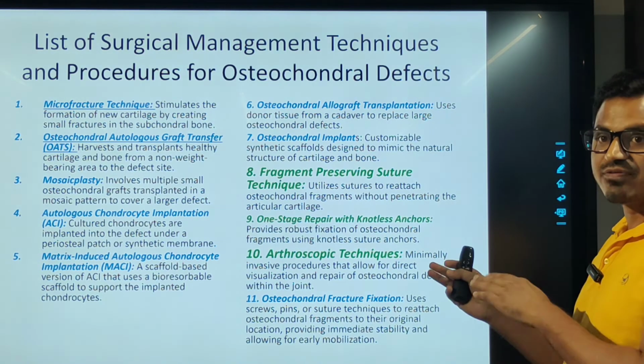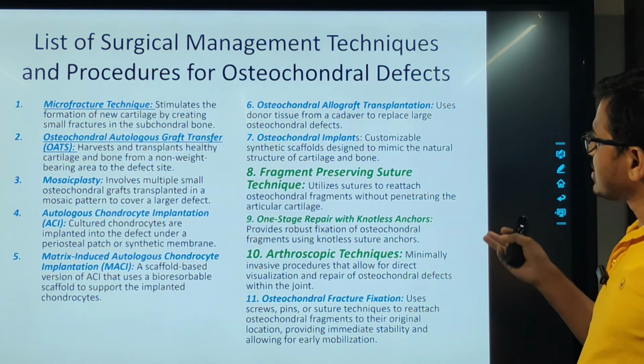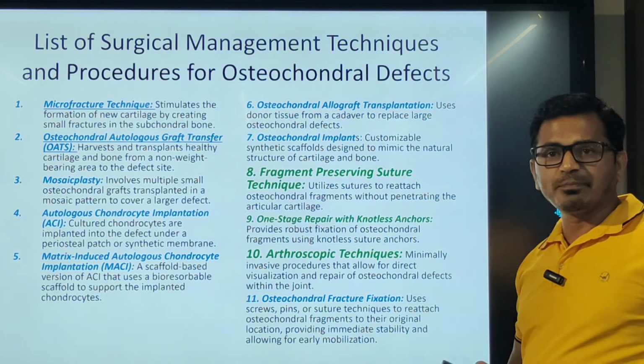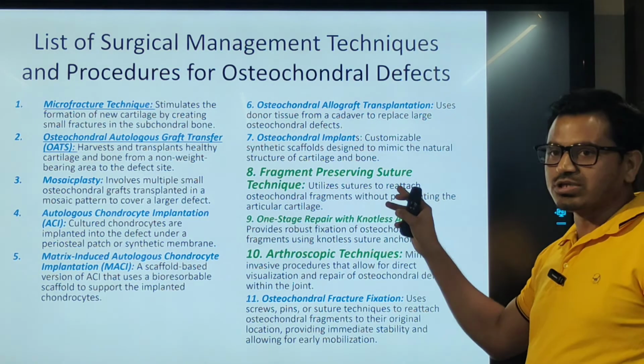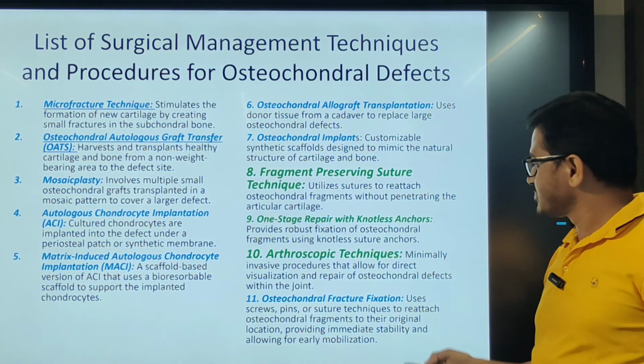Here we will use the graft from an allograft. Osteochondral implants are also available. And last is osteochondral fracture fixation using pins, screws, headless screws. So our focus is on the fragment preserving suture technique. It is actually a video demonstration of our innovative technique.